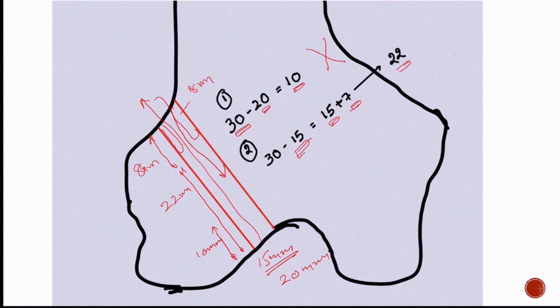So in this scenario, what we can do is use an interference screw in the femoral tunnel, or use a screw as a post here and tie the tendons of the graft around the screw post, which will secure our fixation.